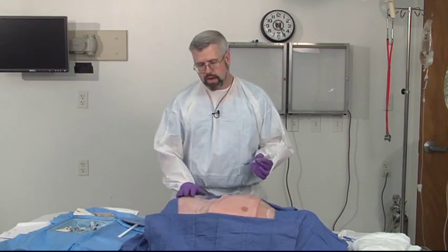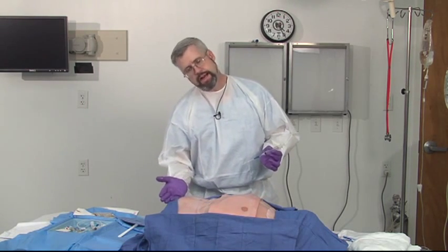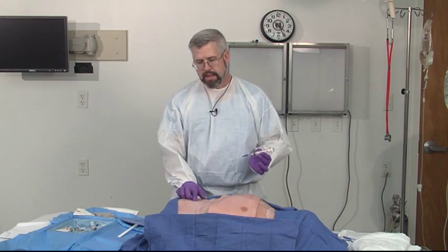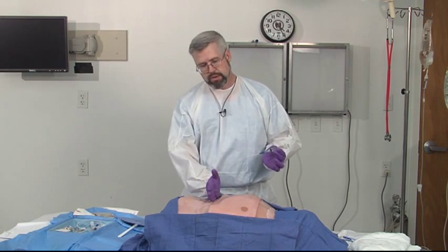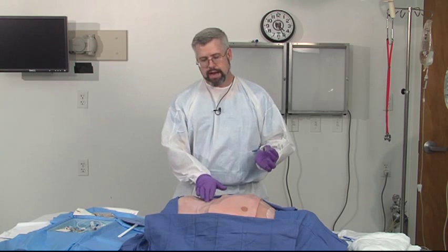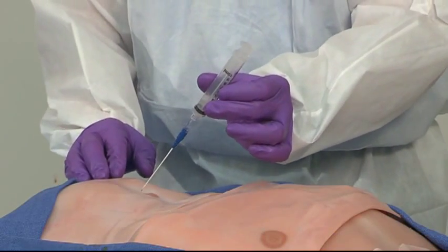The only time you wouldn't go below the umbilicus is if you suspect a patient has a pelvic fracture — you're going to want to go above the umbilicus, because the retroperitoneum actually comes forward to just below the umbilicus, and if you do your diagnostic peritoneal lavage there, you're going to get a false positive tap. Additionally, if the patient is pregnant, the uterus will displace the abdominal contents upwards and you don't want to stick the needle into the uterus, so you're going to want to go higher in the pregnant patient. Once again, the closed diagnostic peritoneal lavage: aim the needle down towards the pelvis.